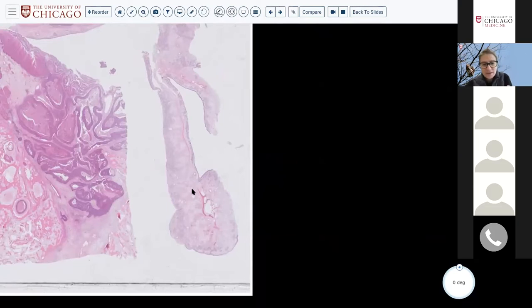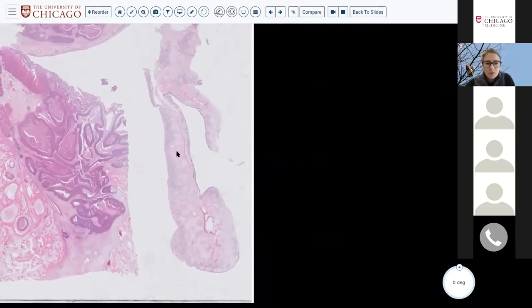You could see the structure with the core of bone, with it wrapping around, right? The function of the turbinate is to warm and moisten the air as it comes in, so that when it hits your nasopharynx and down into your respiratory tract, it's not cold and dry. Hence it's so vascular, right? Because as these vessels dilate, they send out heat, they send out moisture. Okay, great. So this is specifically turbinate.